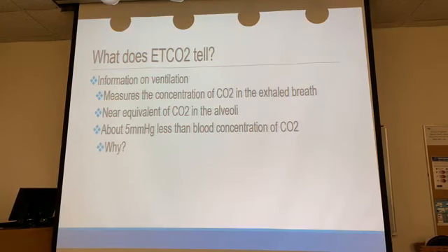So what does end-tidal CO2 tell you? Well, I think the thing that most people think about when they think end-tidal CO2 is ventilation, right? It gives you information on ventilation. It measures the concentration of carbon dioxide in an exhalation, okay? It's near equivalent of the carbon dioxide concentration that's in your alveoli. Makes sense, right? The carbon dioxide is coming from your alveoli right into the CO2 detector. That should be about the same. It's about 5 millimeters of mercury less than the blood concentration of carbon dioxide.